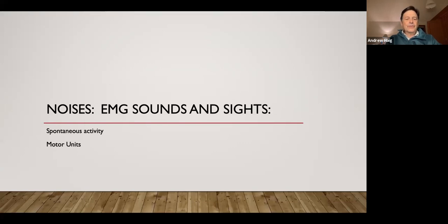So there's two kinds of noises when you put that EMG needle in the muscle. And if you remember, if you're using one of my monopolar needles, you've got an electrode on the skin, which is your reference, and you've got your needle, which is the active, and you've got a ground, which is actually the common mode rejection electrode, which gets rid of all the background noise, right? So with a monopolar electrode, the surface reference stays sort of close to where you're putting the needle in, okay? If I put the reference here and put the needle in my biceps, there's going to be too much background noise between the two, and there'll be some deformity of waveforms and stuff like that. So if you're doing the forearm, you ought to keep the reference on the forearm. And if you're going into the hand, maybe you move it to the hand. And if you're doing the upper arm, maybe you move the reference to the upper arm, and the needle goes in the muscle, right?